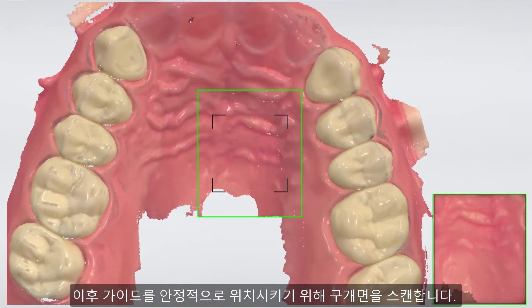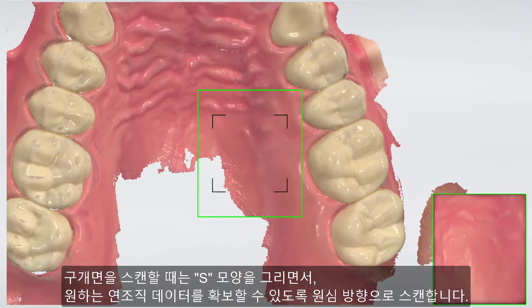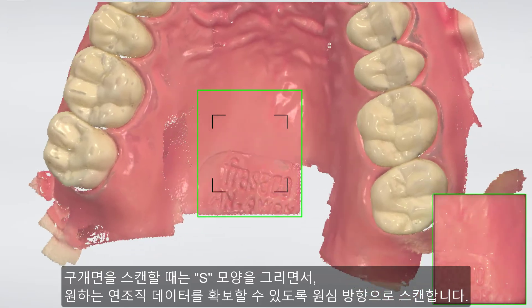On the inside, we want to scan the palate to use it to stabilize the guide. While scanning the palate, use the S shape, moving down the palate to capture the desired area of soft tissue.